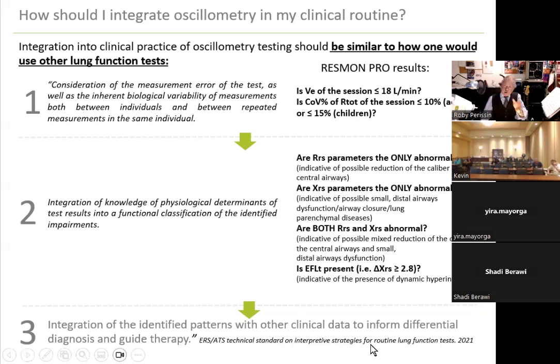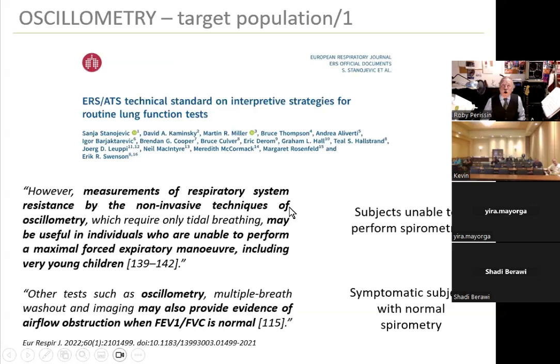So you don't use spirometry alone for a diagnosis, but you also use patient clinical history, symptoms, and results from other diagnostic tests, such as blood gas, DLCO, lung volumes. Now think of replacing your spirometry with oscillometry, because it has the same power and more.